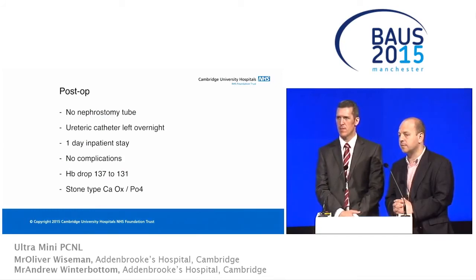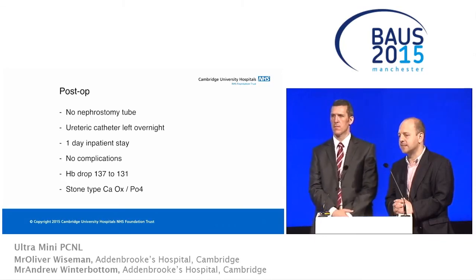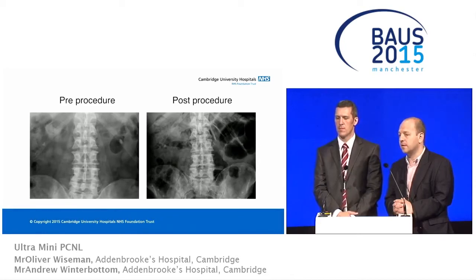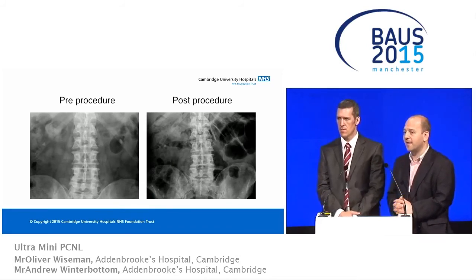Yes, I found when the technique, Janet, removes the wire, I found that initially quite disconcerting. However, the Venturi effect seemed to be more effective because you had a pressure seal. Certainly when I flushed with the side port with a safety wire in, it leaked around the Ultra Mini kit. Yeah, no, that's interesting. I haven't noticed it, but I shall look out for it next time.